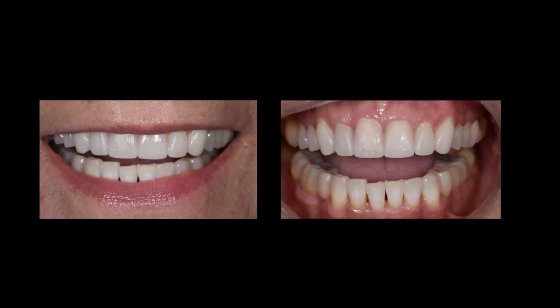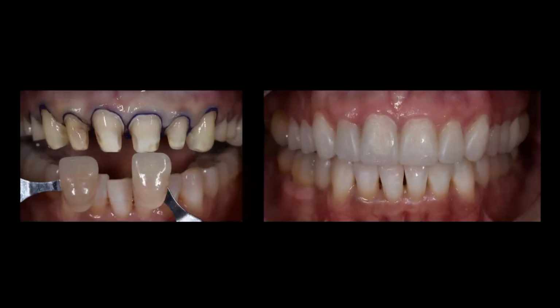all the normal things that we would normally do. You could already see in the diagnostics where we are that we're trying to improve the gingival architecture, get those laterals a little more symmetrical, not exactly the same, but just a little more balanced. I actually think I like the 7 better. Maybe the 10 has a little too much roundness to it, bulbs out a little too much, but okay, we'll look at all that stuff.